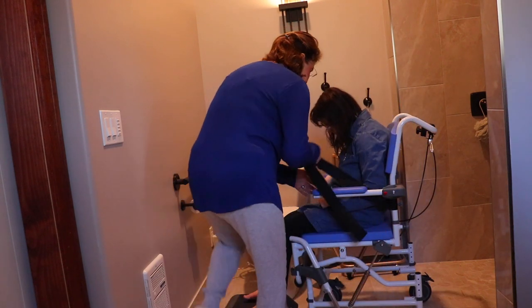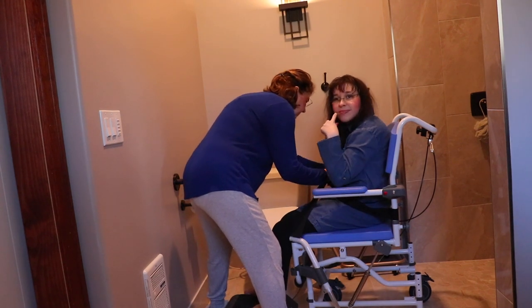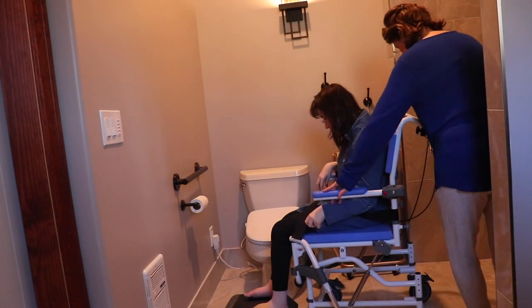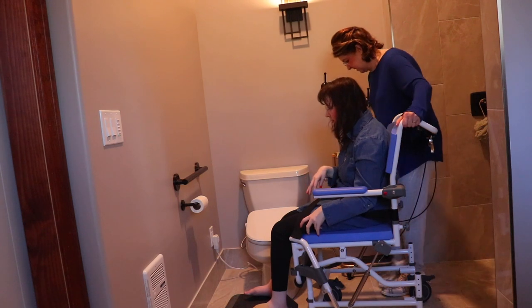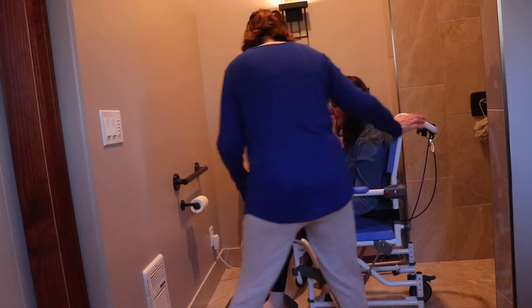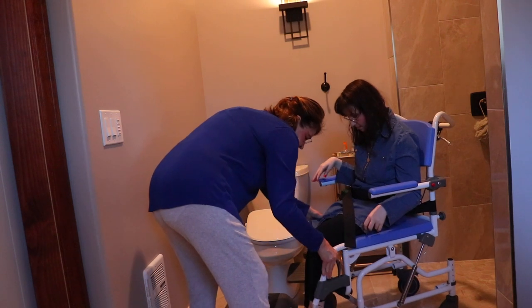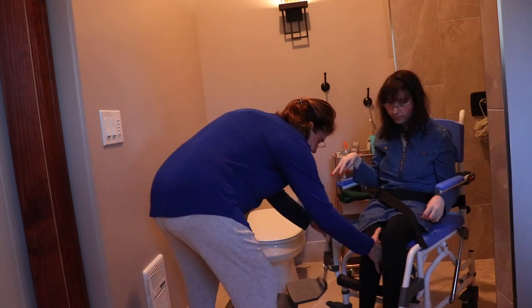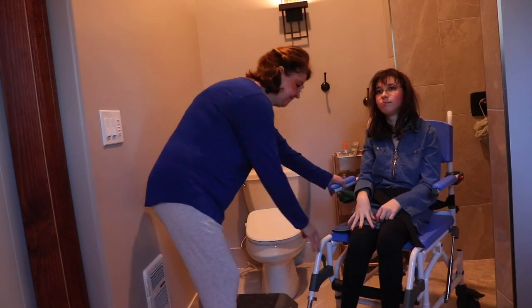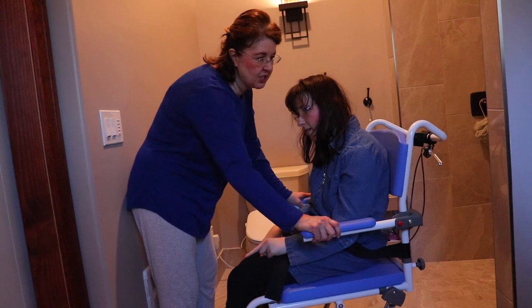Let her buckle you in. Now we've got to do the brakes — here we go. Super loud, I know. Me and these brakes are not friends. There we go — and then she can roll in the shower. Now let's pretend we're at the end of the shower.